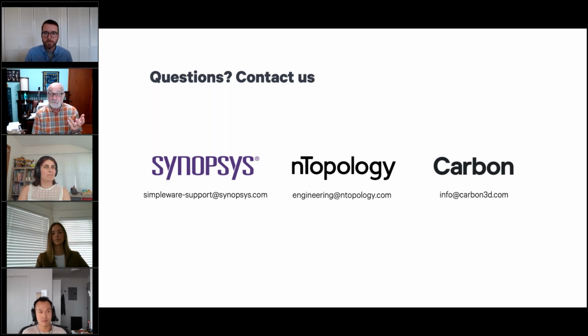Places are already beginning to do this. Mayo Clinic is working around the edges of how to get to that stage, and I think other large healthcare institutions are too, and we'd all love to be part of that process. Yeah, you can imagine that for the entire workflow you've seen here, there are service bureaus that will turn this around in less than a day, FedEx it to you by 8 a.m. the next morning. But what you're describing, you could have one of these cutting guides ready within a matter of hours from the moment of scanning.